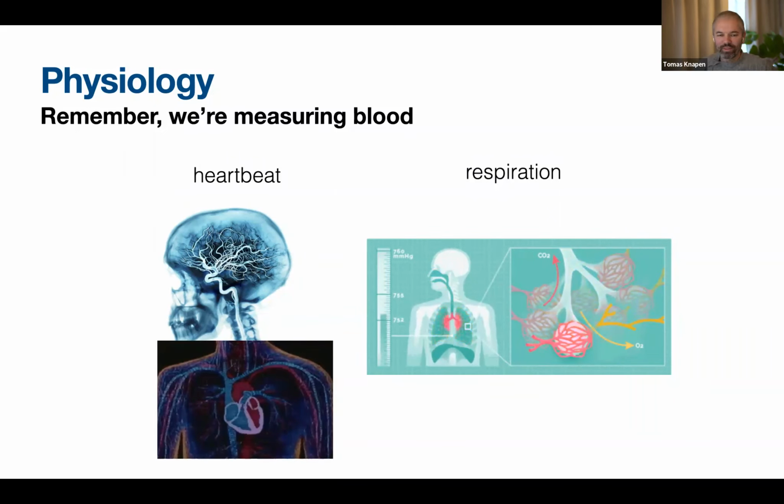Yeah, it's really hard to record fMRI from a dead subject, I realize. But these things are necessary evils. So, okay, that sounds wrong too. But think of them like that. Your subject's heartbeat and your subject's respiration are necessary evils.